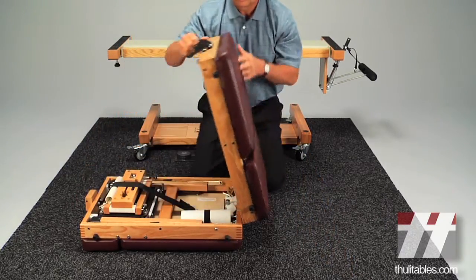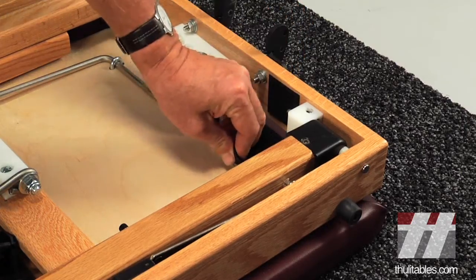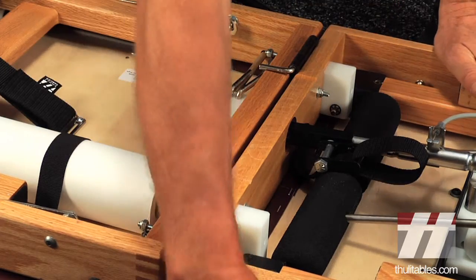Open the table and unlock the thoracic section by unfastening the velcro strap. Remove the two hinge pins that hold the halves of the table together.